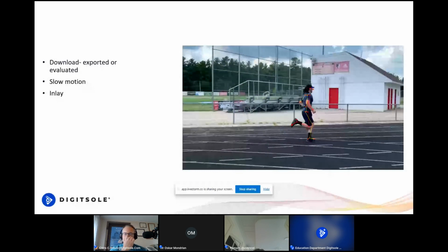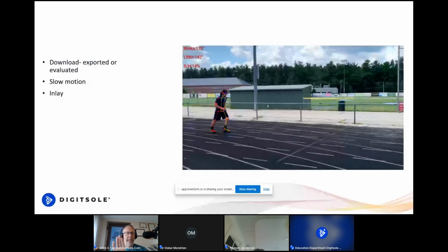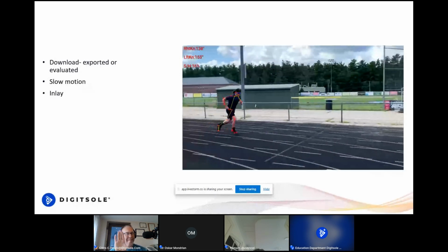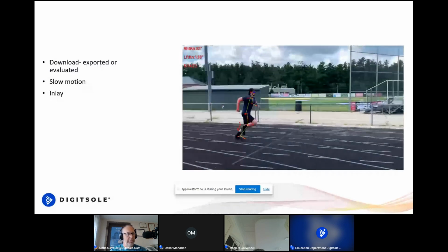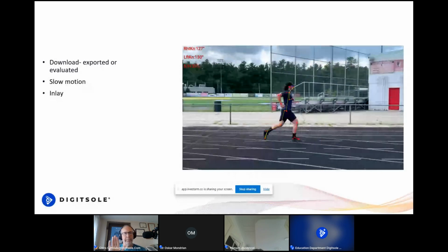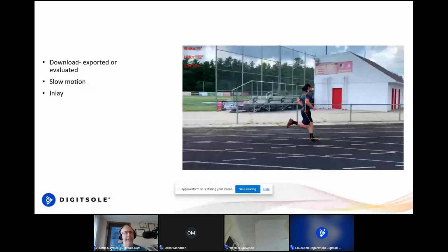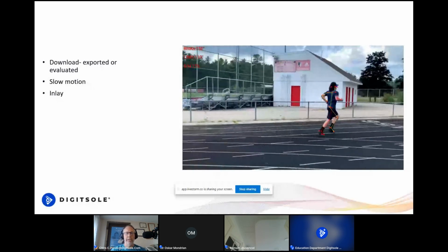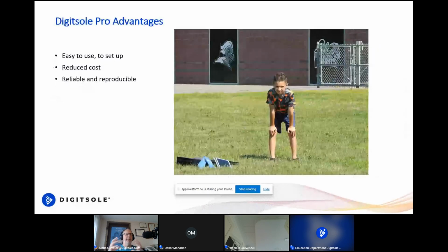So this is me putting it into my markerless motion capture system. And it's the same video that we took, but it saves it right in the patient file and allows me to view it from the mobile, from the online app, show people their position during the orientation. It's not really fancy right now, but it's been a great addition to a visual for showing people. So that really has added to the advantages of using this system, to where, again, it's very portable.